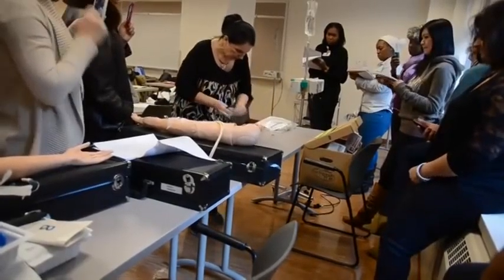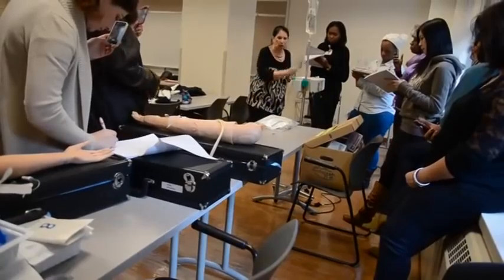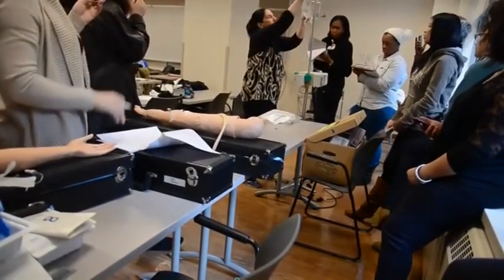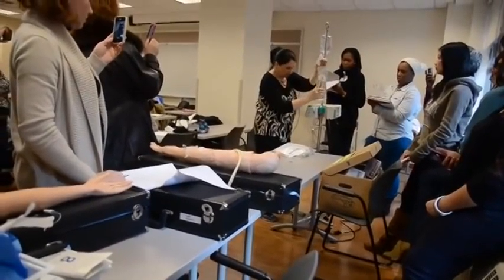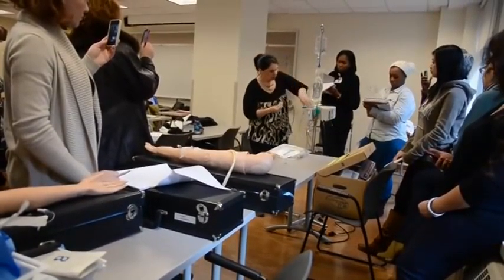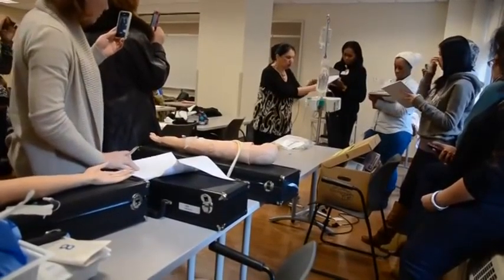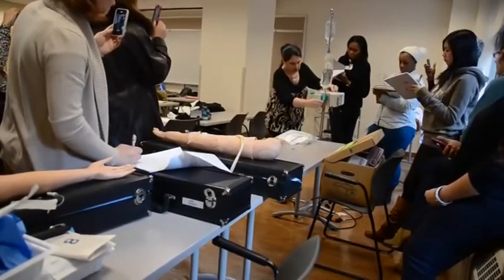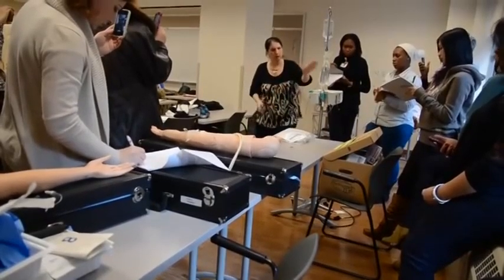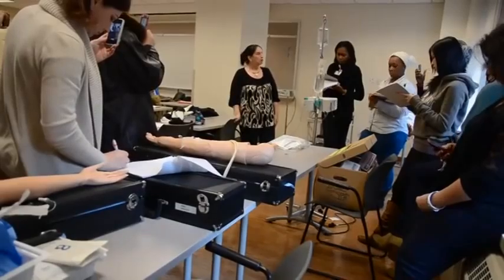I'm going to take the antibiotic, take alcohol, take my label. I don't need a saline flush because my pump is going, and I need secondary tubing because I have to go through the pump — which is high up. I put my bag up, it's labeled. I lower my main line. The pump is still going — I haven't done anything. Now I'm going to alcohol wipe this port. See how it's going through the pump? I'm going to clean it off and connect it. For number three, always connect your IV to the higher port.